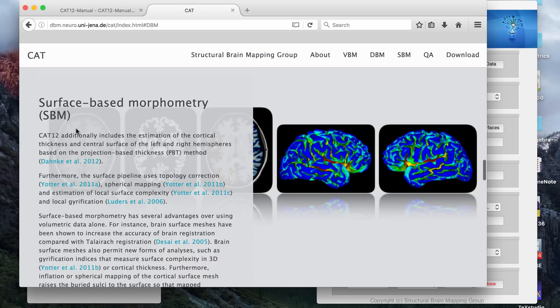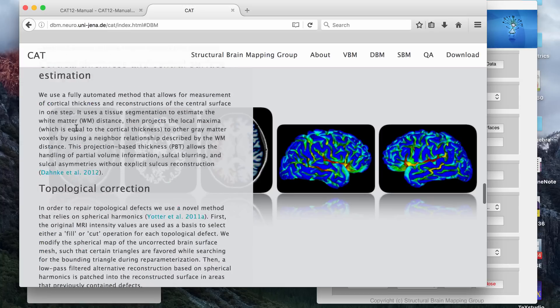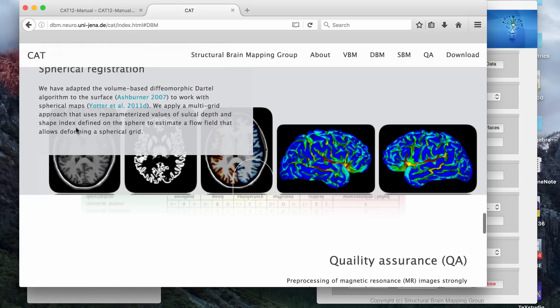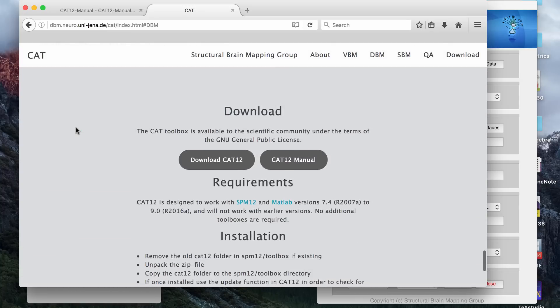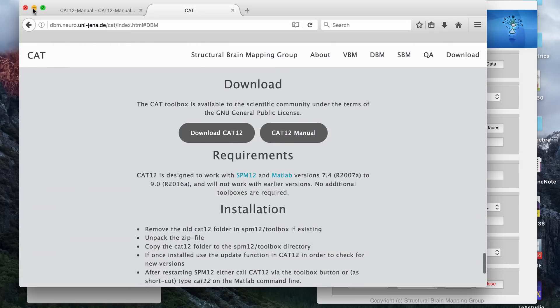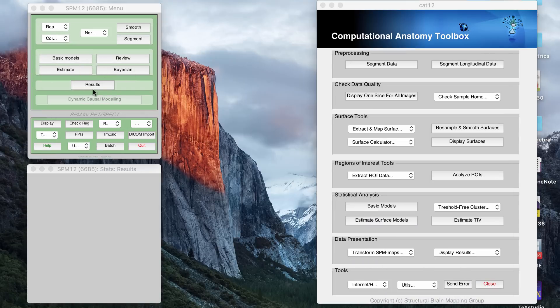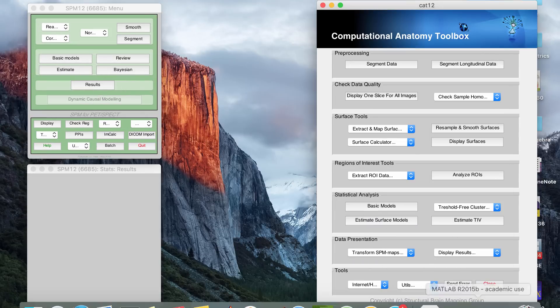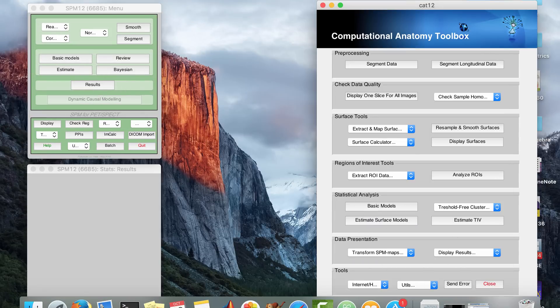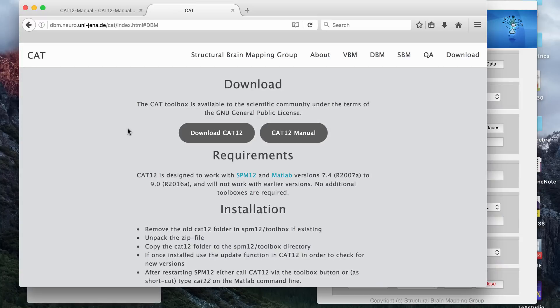And you can also do something called SBM, all using the same program. It makes it really simple, because I think even SPM has its own way of doing VBM, but I like using the CAT 12 method better because I think it makes it even easier.